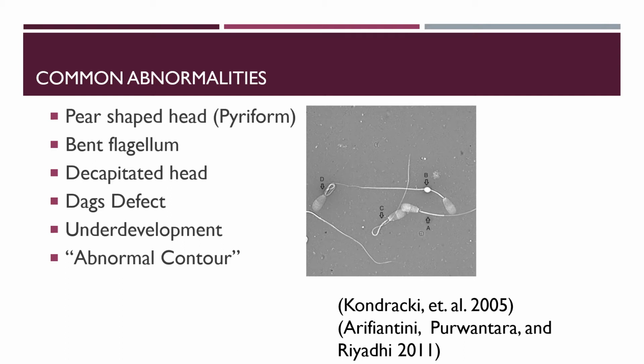Abnormalities are always going to occur in ejaculates. There are never going to be perfect ejaculates with completely normal sperm cells all across the board. Abnormalities will always be present, but the severity and density of these abnormalities is what determines whether or not it's going to affect fertility.